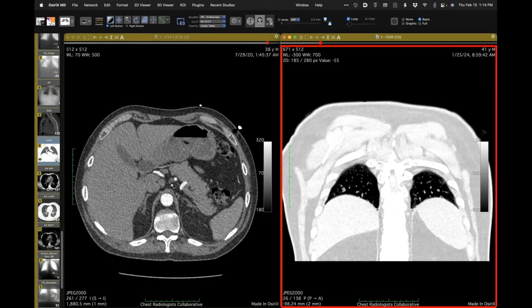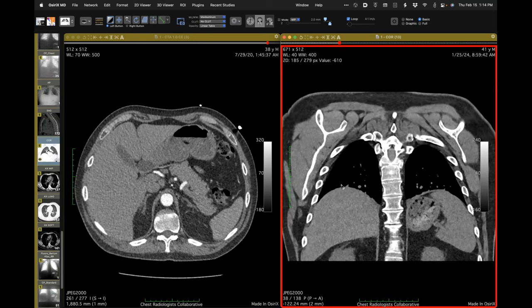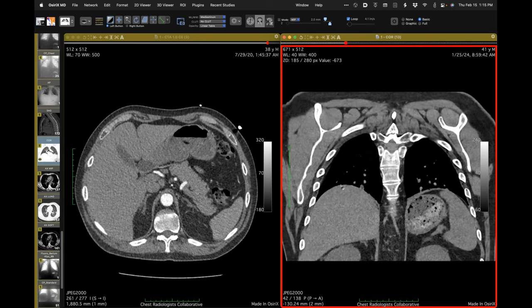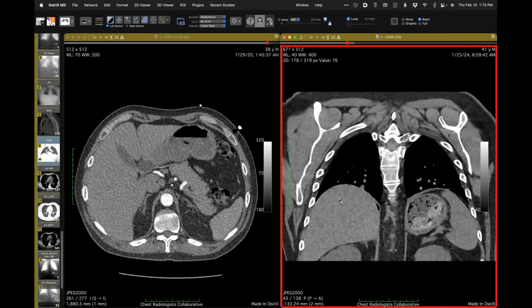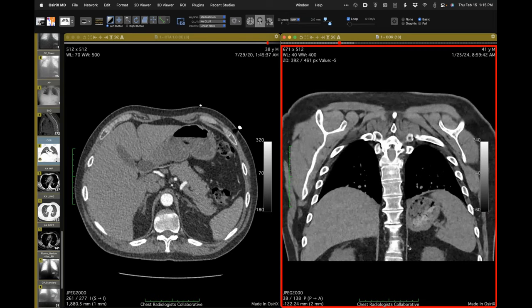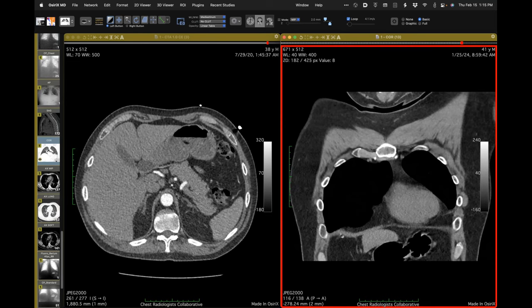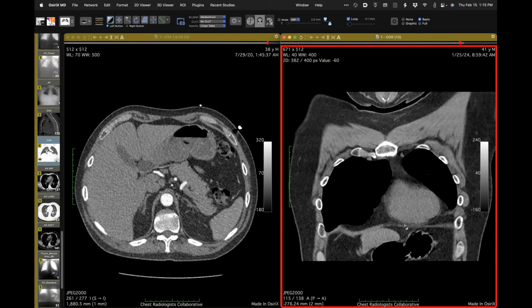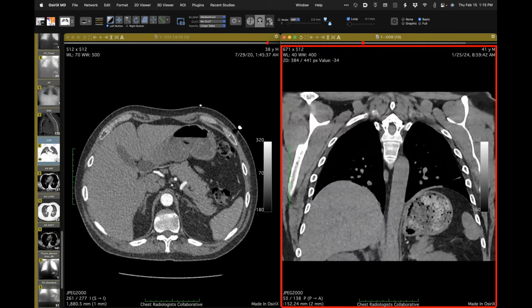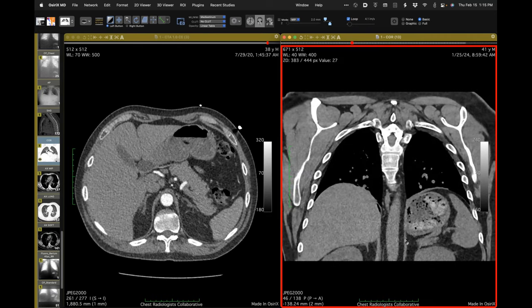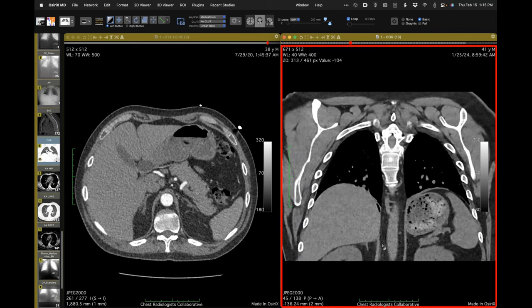Typically with substantial hemi-diaphragm paralysis, the entire muscle of the diaphragm would be thinned. Here there's still pretty good muscle. Going anteriorly in the chest, this is not the muscle bulk I would expect with substantial phrenic nerve bilateral hemi-diaphragm paralysis over months. I don't think there's substantial injury. The crura are not that thin — maybe a little — but time will tell.